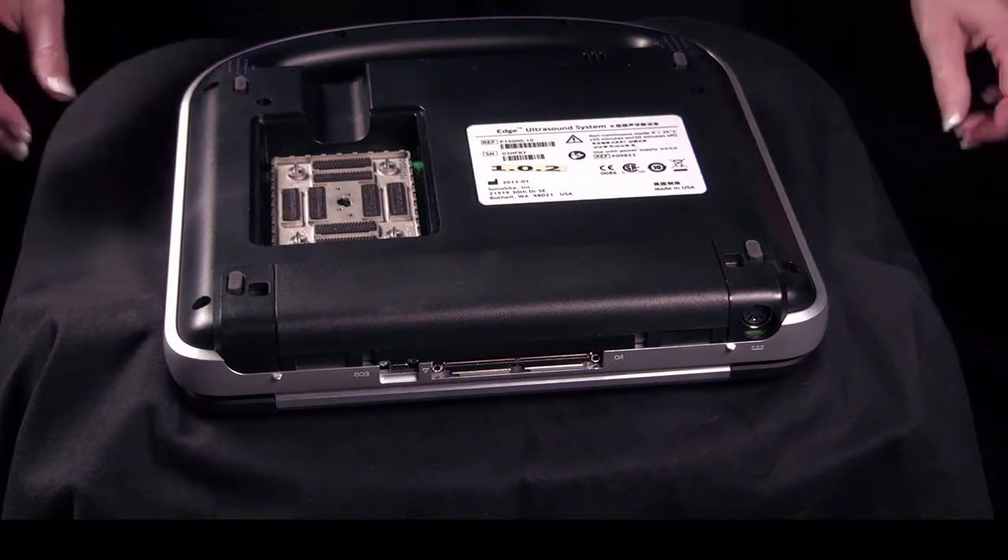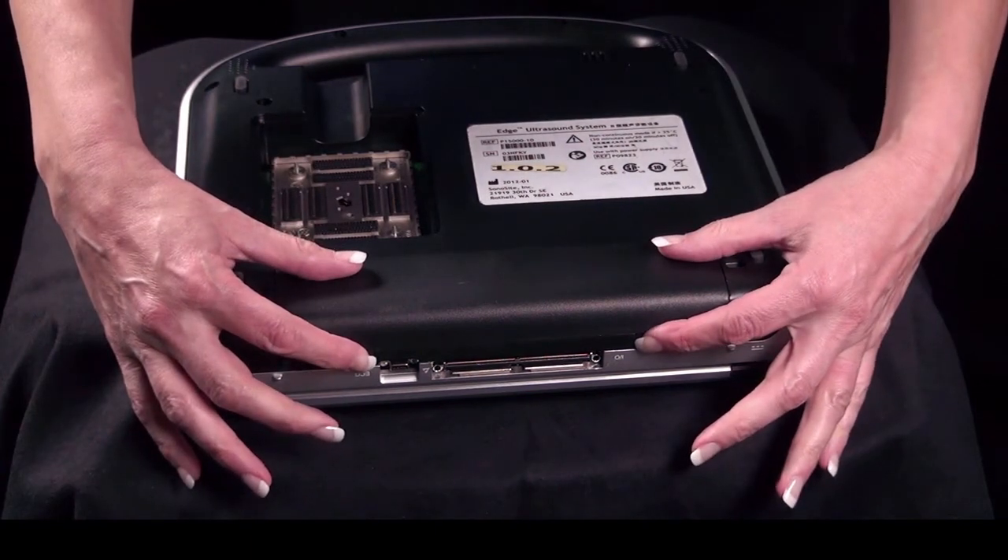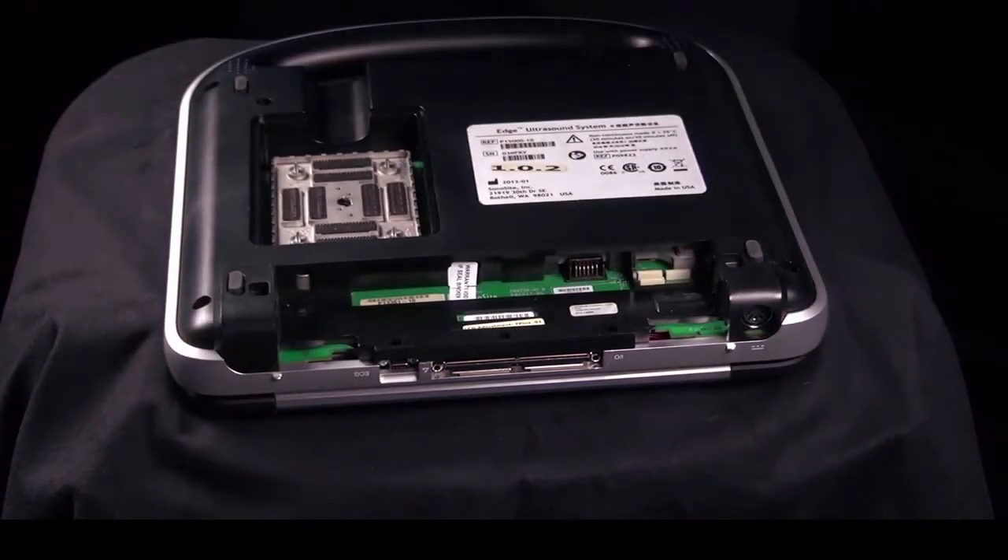To remove the battery, slide the two locking levers in. Slide the battery up, lifting the battery from the compartment.